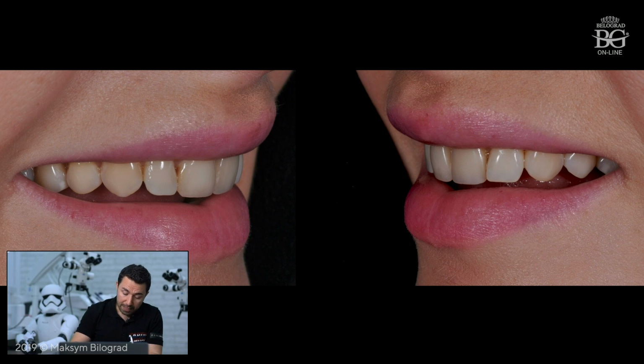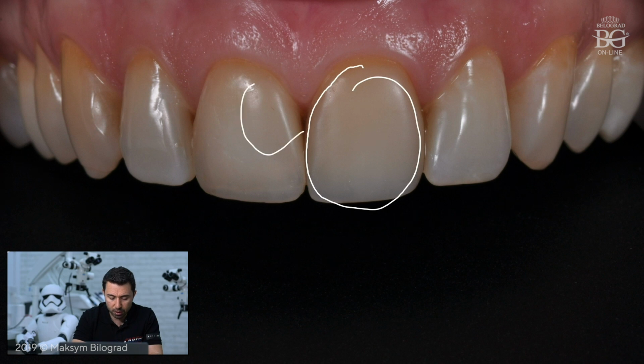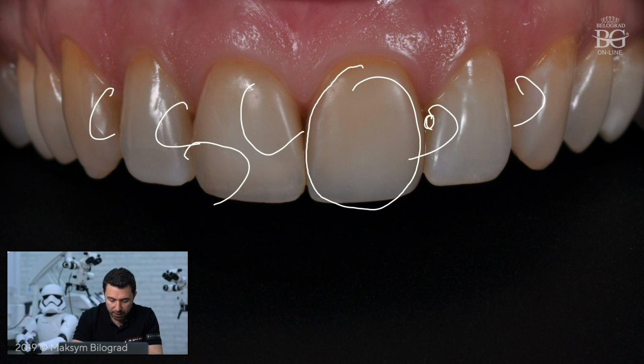Okay, so let's go back to the intraoral picture. We would like to analyze also the intraoral picture because it is super important. Take a look here. Here is a composite restoration, also a composite filling here, lateral incisors, canines, some caries defects here. So all this has to be evaluated also before you start doing something with patients.